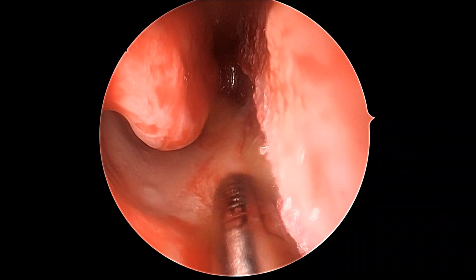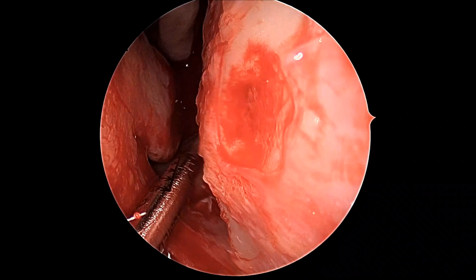It's very important here — we don't want to go all the way to raw bone or cartilage, but to leave a very thin layer of perichondrium intact, so as to give a good bed for the skin graft.